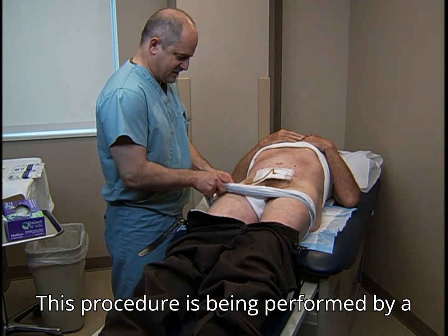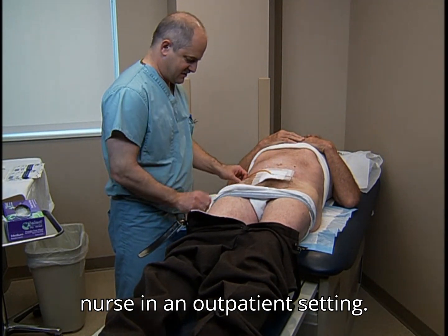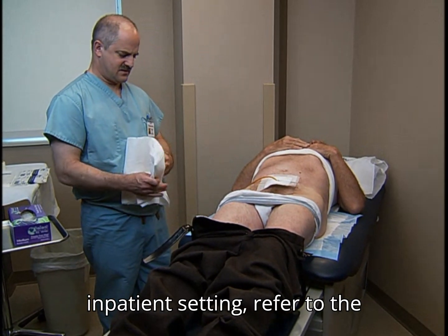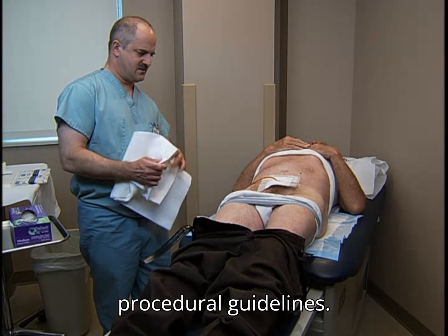This procedure is being performed by a nurse in an outpatient setting. When the procedure is done in an inpatient setting, refer to the procedural guidelines.